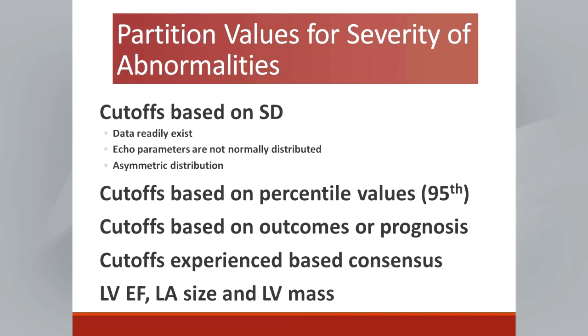When you think about it, something that is also extremely interesting is that in the previous guidelines, for every parameter, we provided cutoff values of severity. By that I mean normal, mild, moderate, and severe. And these were done in a relatively arbitrary way.